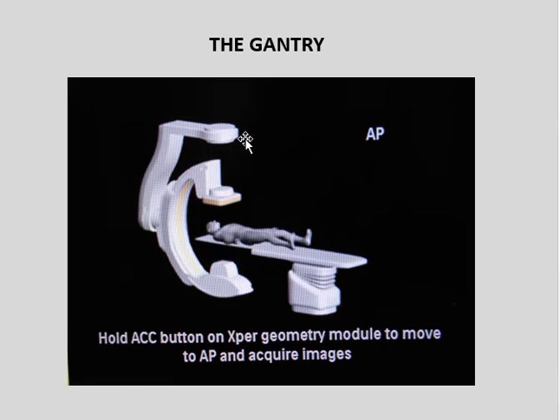And this shows you how the gantry rotates around the patient. The patient lies on a table, and the gantry can be roof-mounted or floor-mounted, but it has a series of knuckles and axles, so that this C-arm or U-arm rotates around the patient in that direction. Laterally, it can also rotate longitudinally along the length of the patient towards the feet or towards the head.